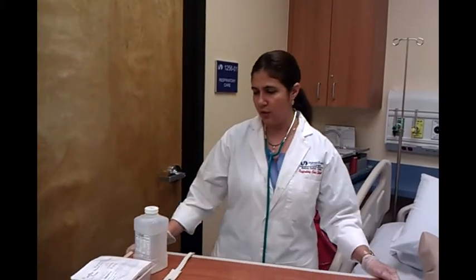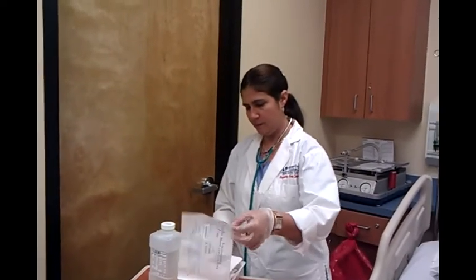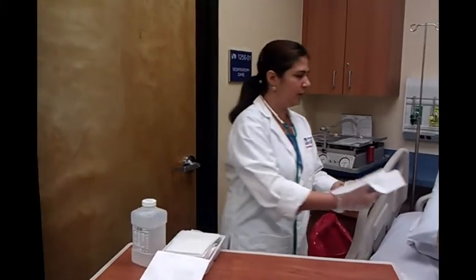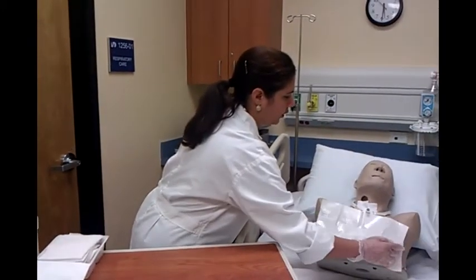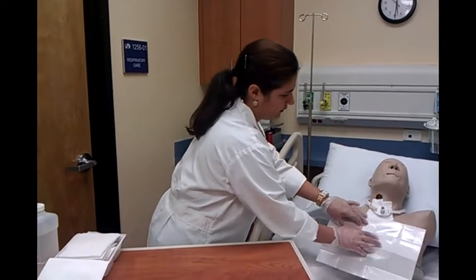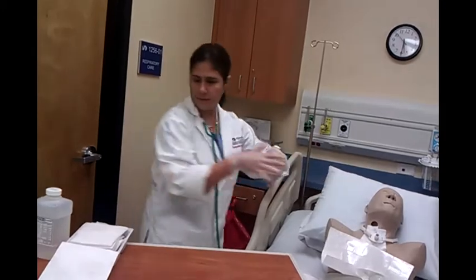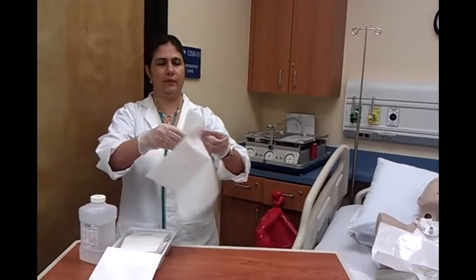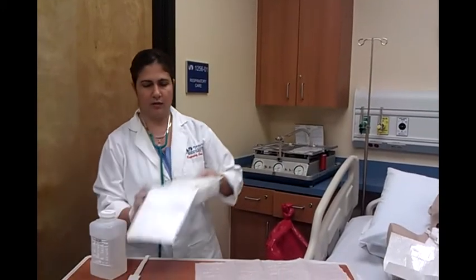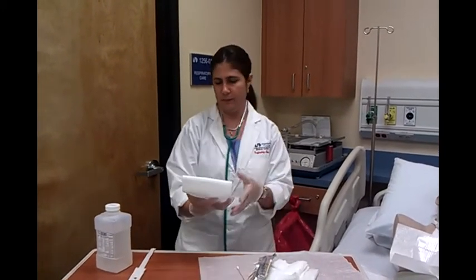My table is sterile already and clean. I'm going to open the trachea kit. The first clean sterile sheet I'm going to put over my patient to protect him, so his clothes don't get dirty. The second one I'm going to open on the table to pour all the trachea care supplies. Everything has to be sterile.